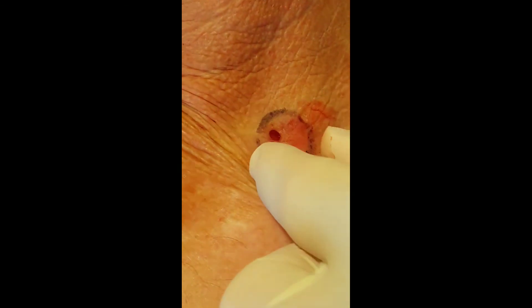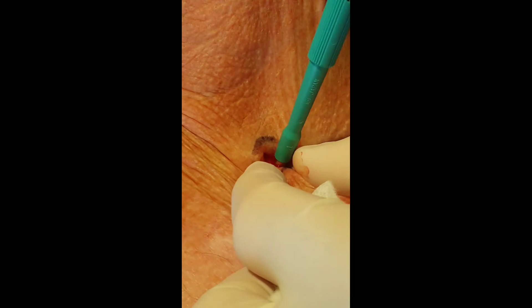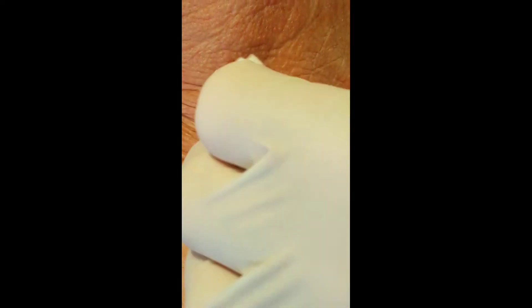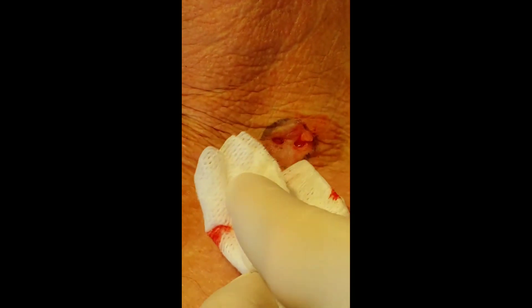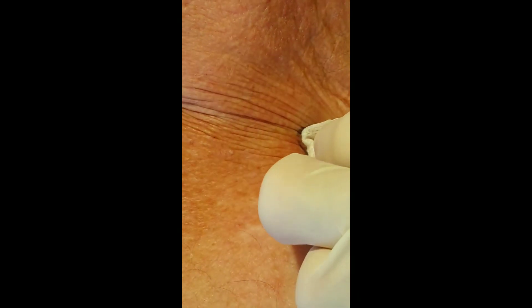It is always a good idea, if able to, perform at least 2 biopsies. Again, the aim being to give the histopathologist enough tissue to make a reliable diagnosis.